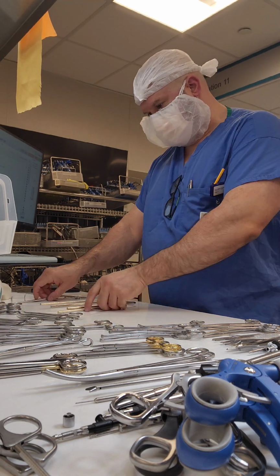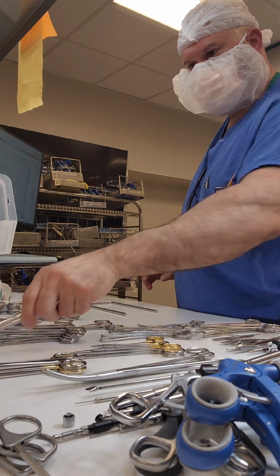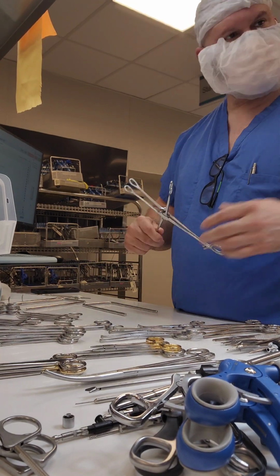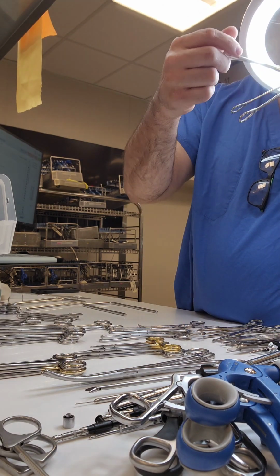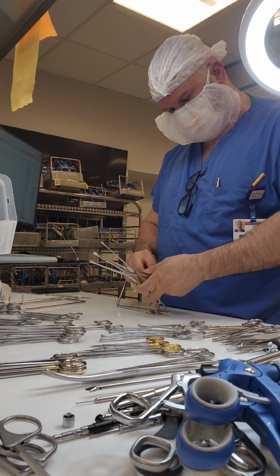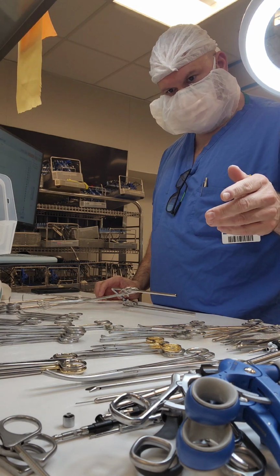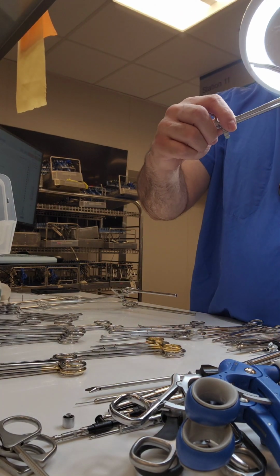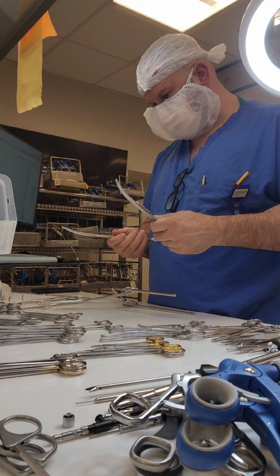And then I go ahead and look for my section in the count sheet that talks about the stringer, right? So that's going to go in the bottom of my basket, utilizing my lighted magnification. Okay. Instruments that are over 8 and 9 inches, over 7 inches really, 7 1/4 is probably limited, but with 8 inch, 9 inch, 10 inch instruments, the tap test really isn't effective.